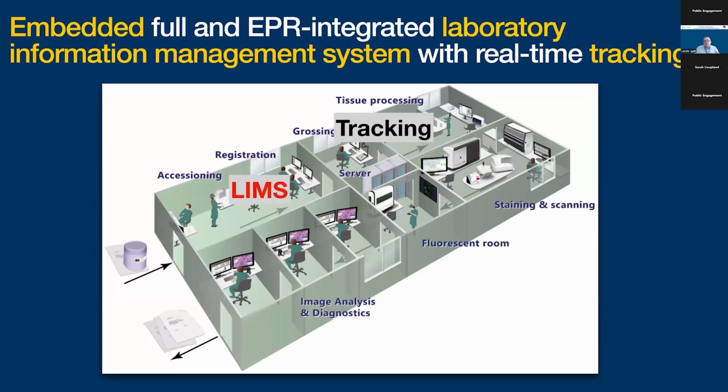These are the two first elements, and these are taking the sample. We'll go through it in a moment, from essentially booking in up to the level of processing the slide itself.